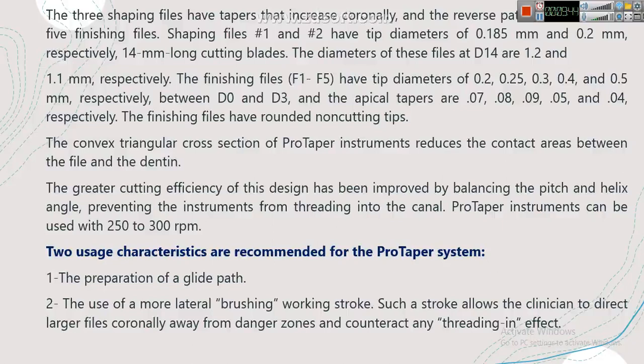The convex triangular cross-section of the ProTaper instrument reduces the contact area between the file and the dentin. So the greater cutting efficiency of this design has been improved by balancing the pitch and helix angle, preventing the instruments from threading into the canal system.